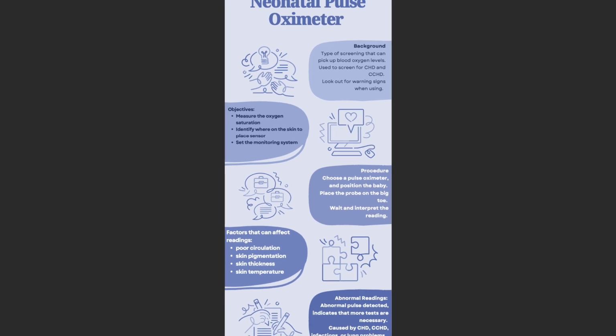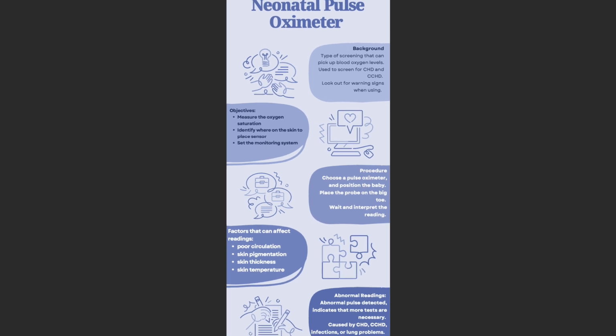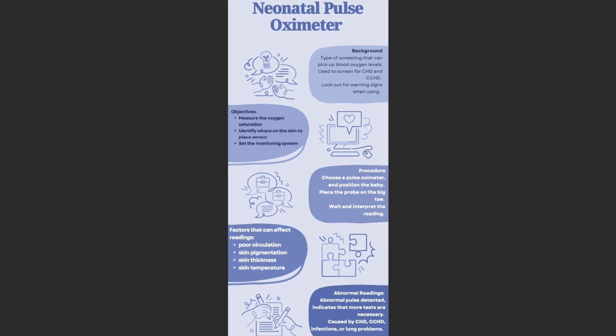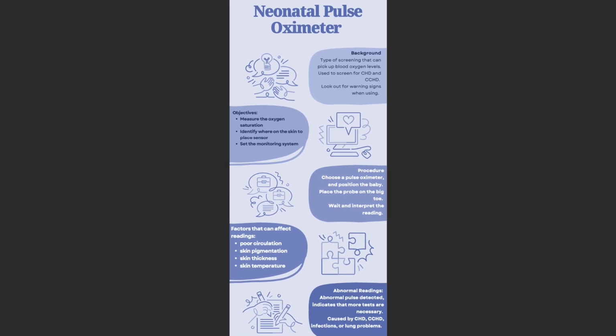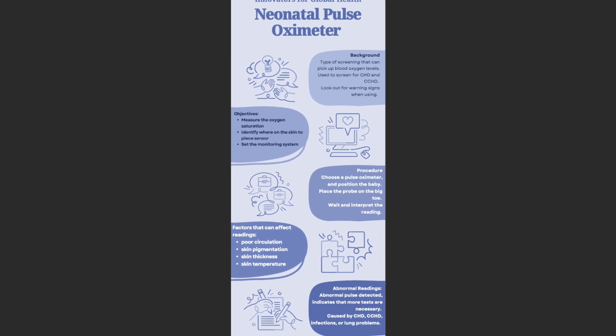Step 1. Place a pediatric foot pulse oximeter. These will be smaller in size and are designed to fit smaller toes of babies. Step 2. Choose a comfortable position for the baby. The baby may be placed on your lap or a soft surface such as a changing table.